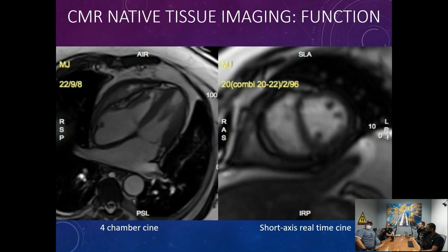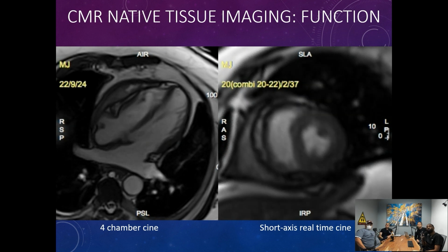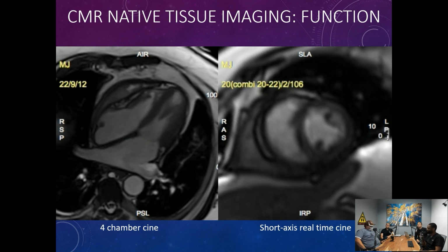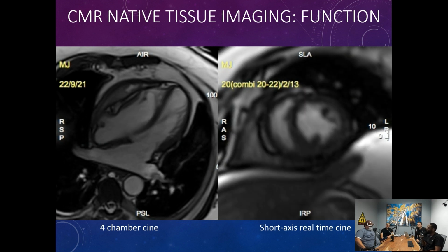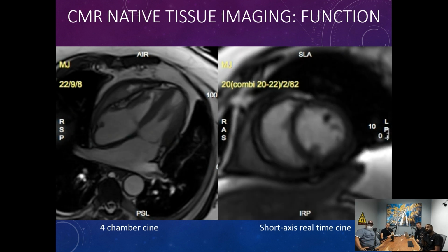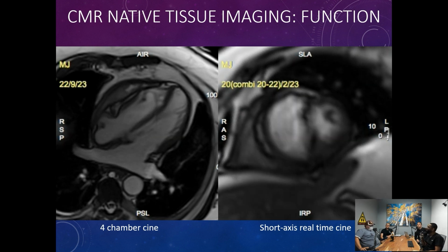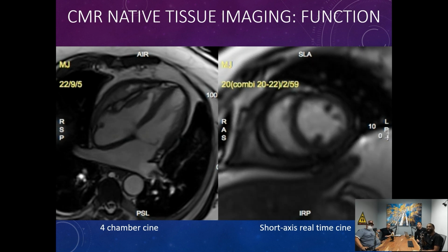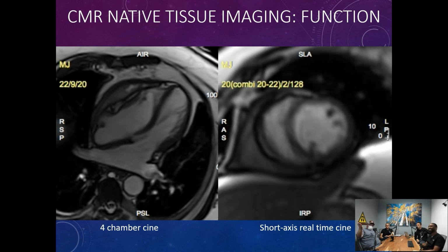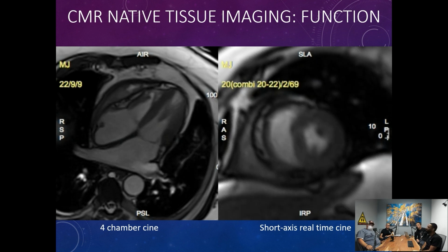And this is also a nice illustration. We were talking about the importance of breath holding earlier, but you can do some imaging on a patient that can't hold their breath. It's not as good, but you can get something at least from patients, with that short axis real-time imaging. And as technical things like compressed sensing come along and get better, we're going to be able to do more and more free breathing exams on patients. Nice. So eventually you won't even have to hold your breath anymore for any MRI. You just lay in there. But it's just a great example of how with MRI there's almost always some sort of trade-off. So nothing is free.